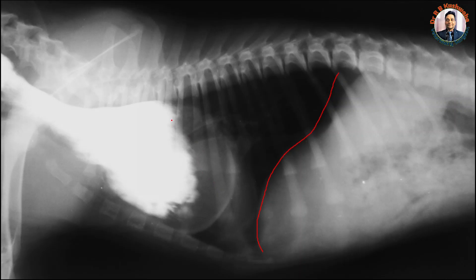Even if you see, the barium sulfate has not filled the whole esophagus. But still, you could see the boundary of this dilated esophagus.